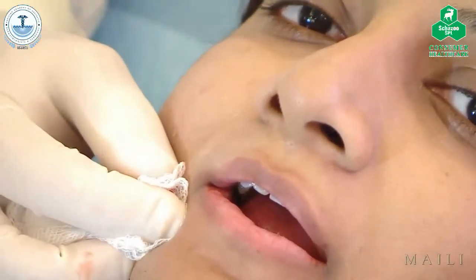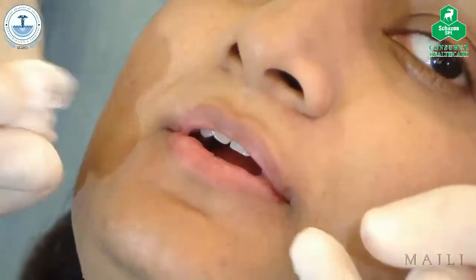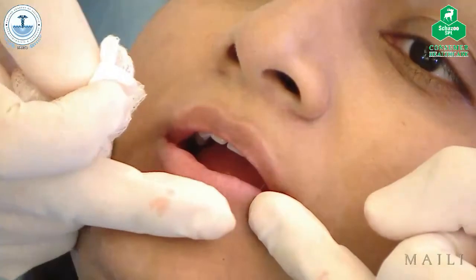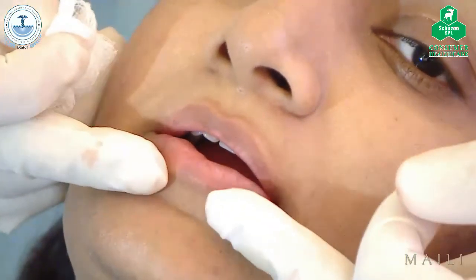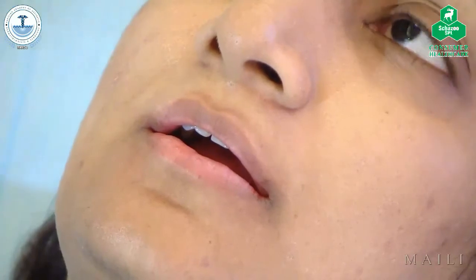I just want to add something. Yes. I want to use a bit of precise, because it's a workshop, right? So I'm going to use a bit of precise just to define the eversion on the lower lip closer to the contour, because the upper lip has a nice shape, the lower lip needs a little bit of shape. That's all. It's very natural. Very, very natural. There's one question. Yes.